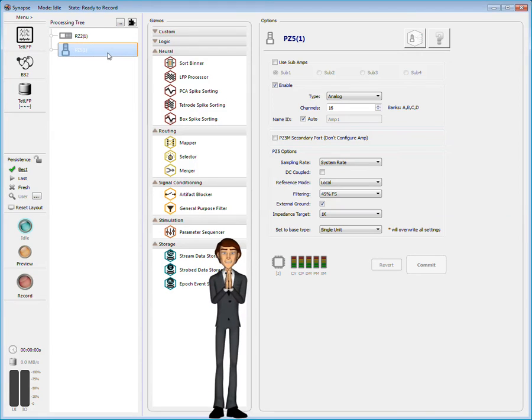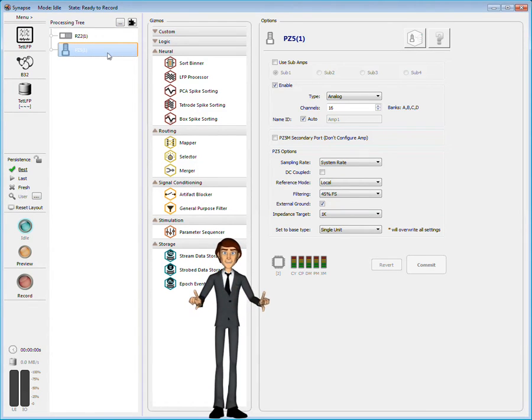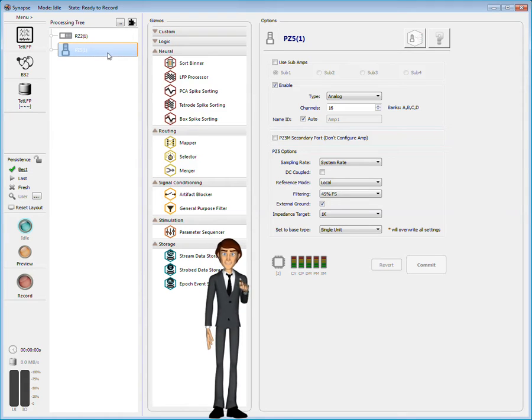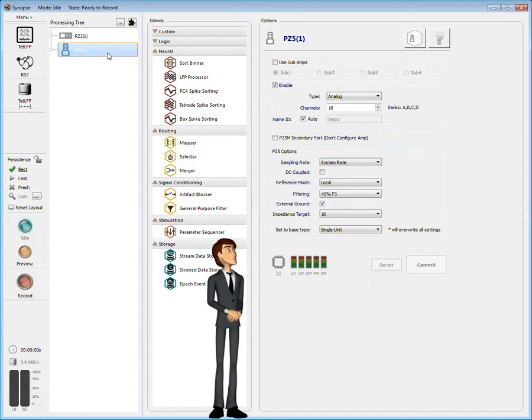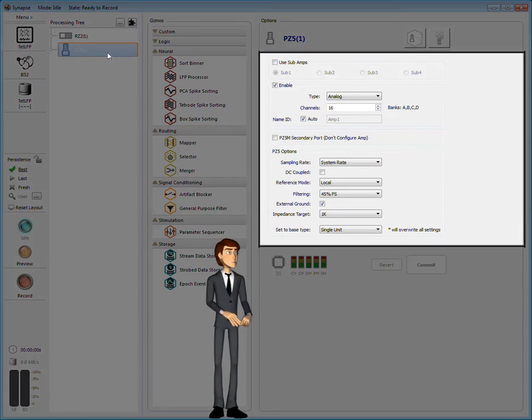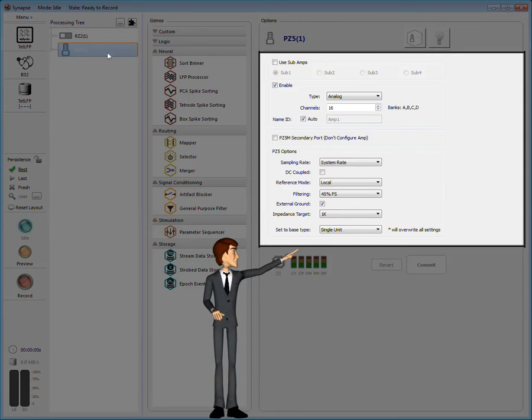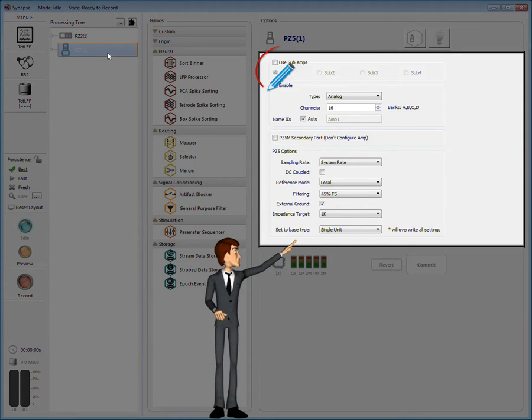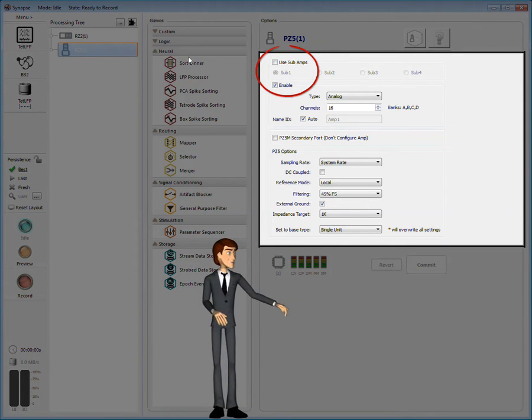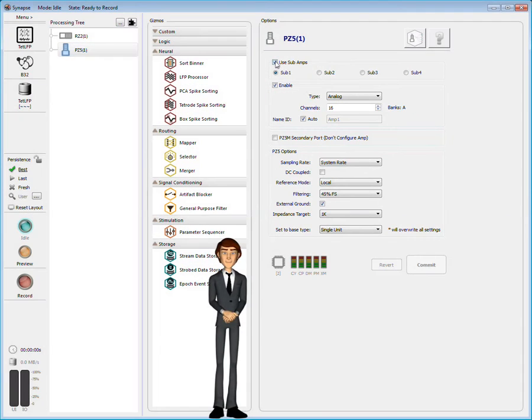Before we add gizmos, we need to modify a few of these experiment-specific settings. The PZ5 is a multimodal device. It can record different kinds of signals on independent logical amplifiers defined here. Let's give it a try.